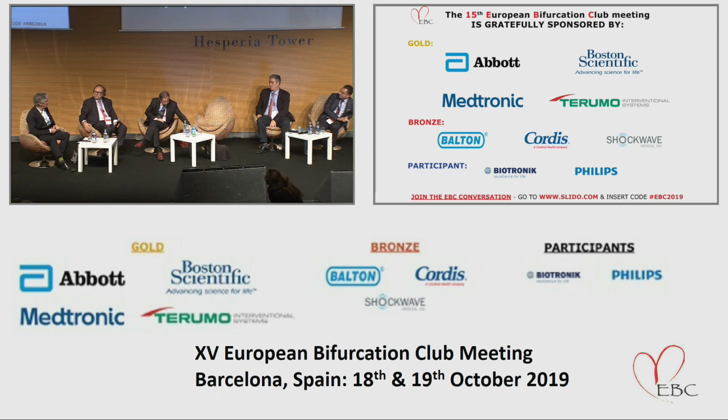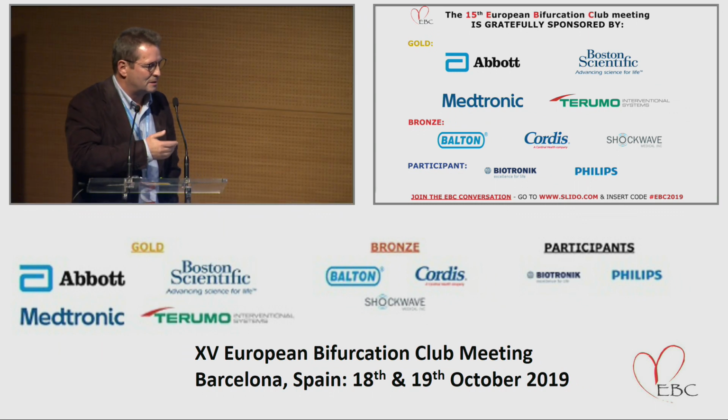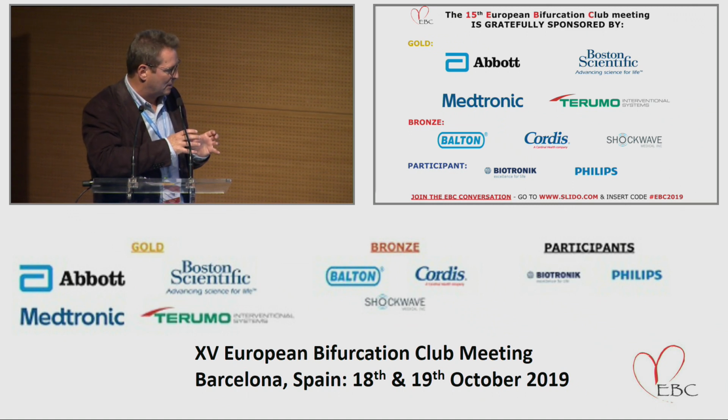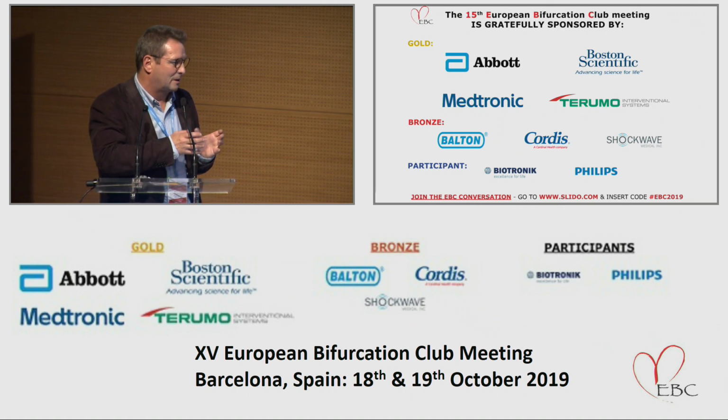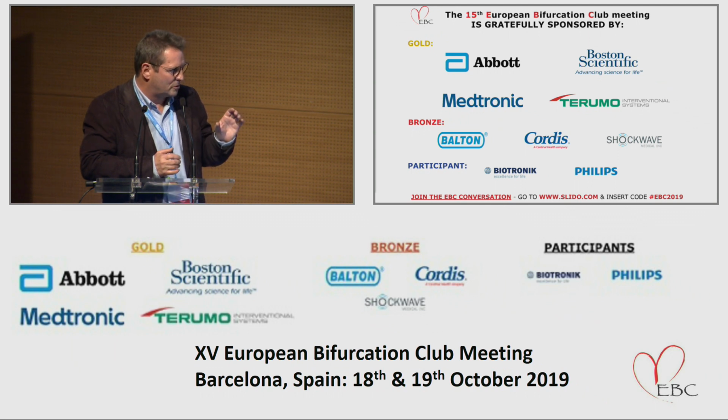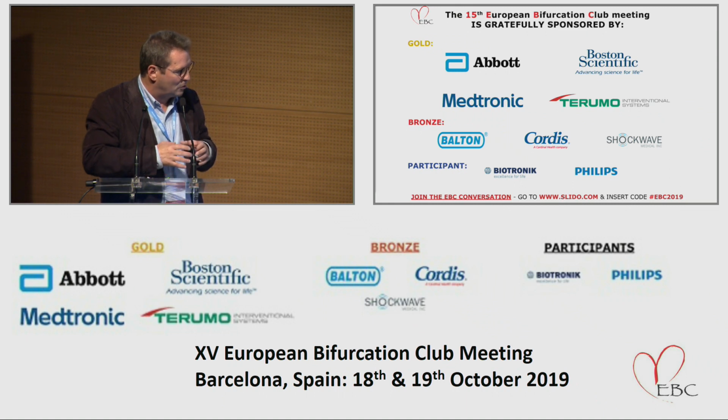Okay, yeah, well, but I think one of the beauties with this stent is that it is dedicated to take care of the proximal part of the left main mostly. And I think one reason maybe for using it for other purposes is that if you go below the first 3 crowns and dilate, you will have an opening diameter of over 6.0 towards the circumflex.